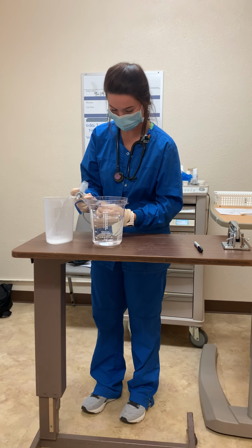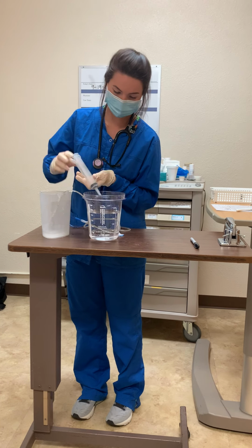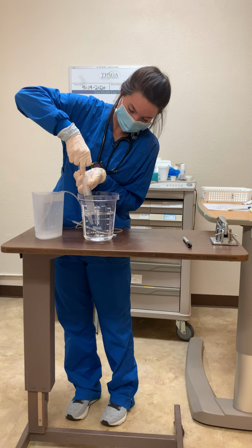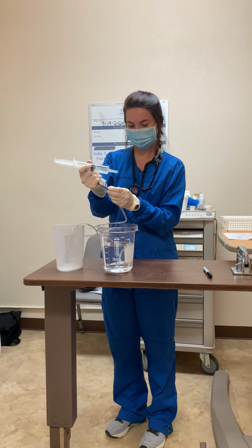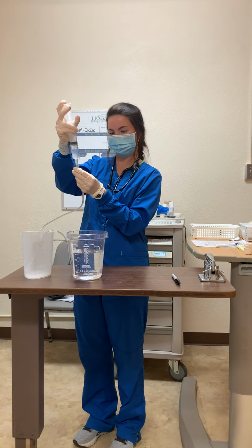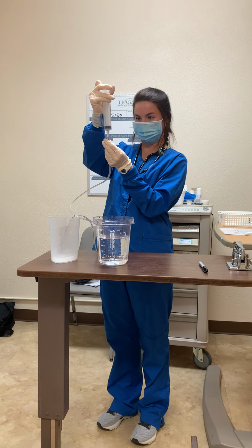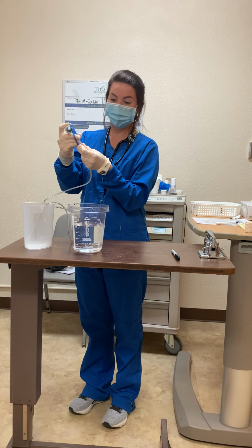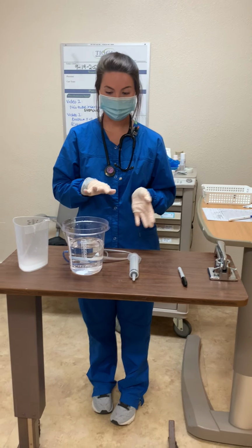And after that one, you'd want to flush it again with your 30 to 60 mils of water, just to clean out the tube, make sure that none of it got left. Okay, and then Joanne's medication would be administered. You'd make sure she was all set in her room there, and come back 30 minutes later to check on her.